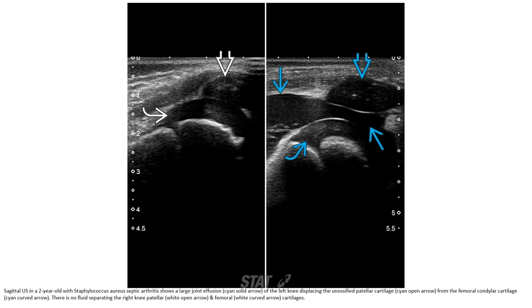This is an ultrasound image in a two-year-old with suspected septic arthritis. There is a large joint effusion of the knee, displacing the unossified patellar cartilage from the femoral cartilage. There is fluid separating the patellar and femoral cartilage.